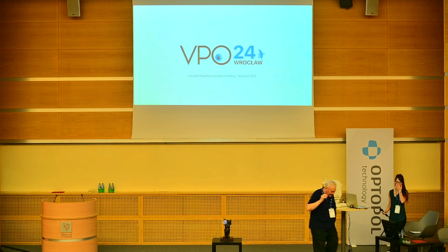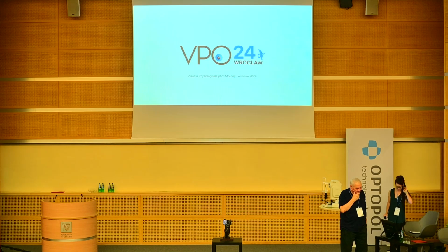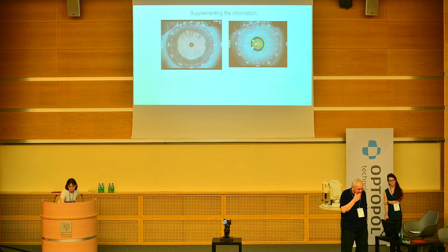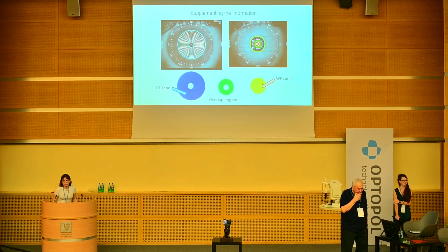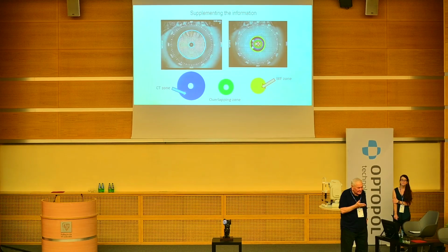The last slide of your presentation, you said that you can cover the placido discs and the retina without this hole, and actually simultaneously. But from another hand, in which value do you want to cover? As a wavefront reconstruction, or?